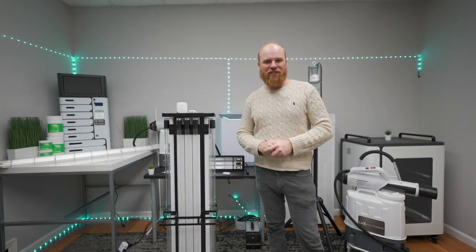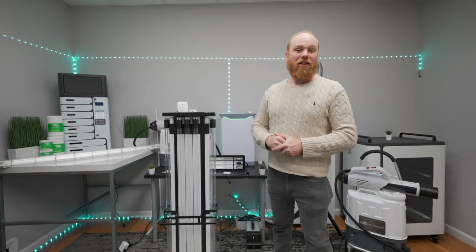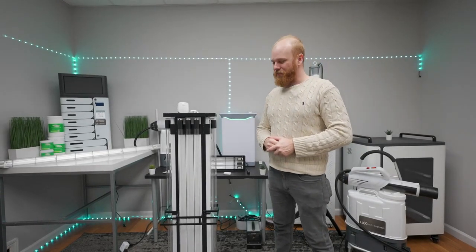Hi, Stefan here, marketing manager at Lux Disinfect. Today we're going to be reviewing the Lux Disinfect UVC Ultra tower.